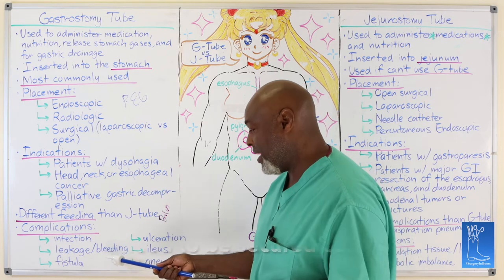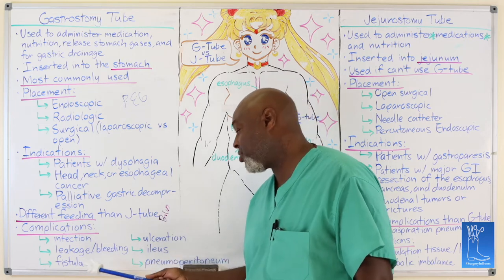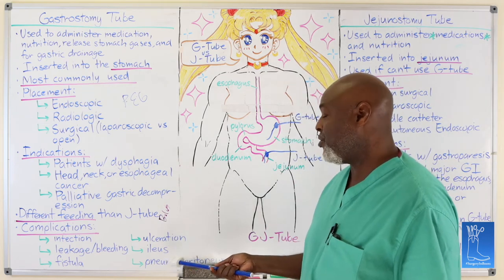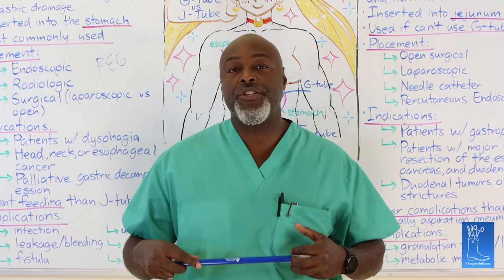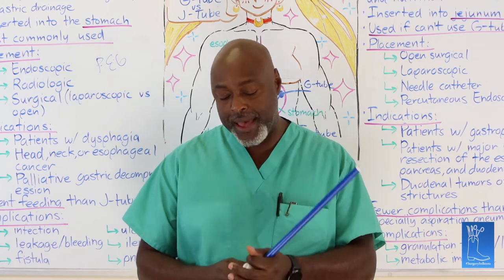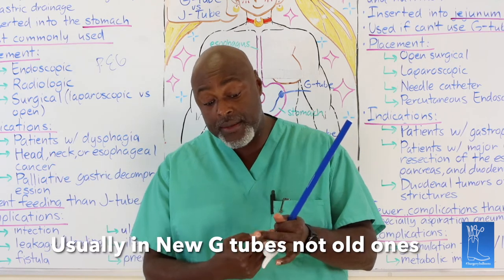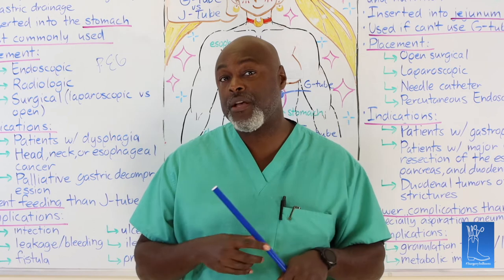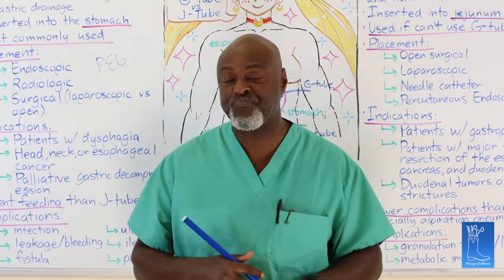Now, they also bleed because this tube can move side to side. Once you pull it out, if that hole doesn't heal, you can get a fistula. You can get ulcerations where the tube is moving if it's not taped down to the sidewall. Ileus happens initially, but usually resolves. Pneumoperitoneum, that is when you have air in your abdomen. Air in the abdomen from a G-tube usually occurs because the bolster, which holds it snug to the skin, is not tight. So what happens is it loosens up a little bit, air leaks in here, and then gets into the abdominal cavity, or leaks out of the stomach into the abdominal cavity, but you don't necessarily have to have GI content. So you'll have patients come in and get an x-ray for something else and they have free air, and they have a G-tube. It's not as big of a deal, but you have to make sure that it's not a perforation. Hope that covers G-tubes.